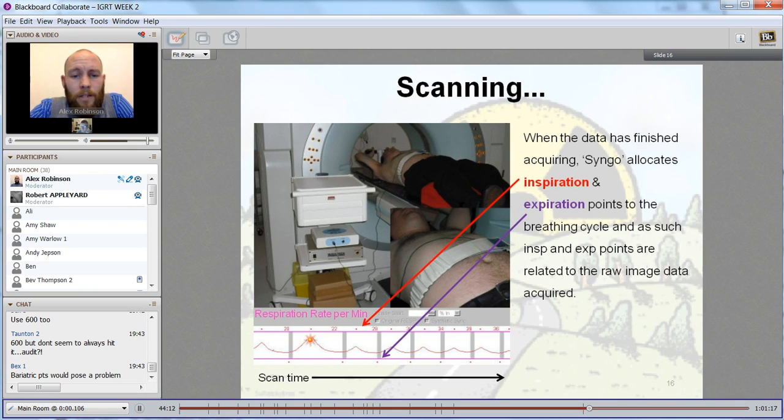Now on the system, it'd be lovely if this is how it turns up. However, it never does. You have to change your settings, and you've got amplitude, and my mind's left me what the other thing's called. But either way, we can change this to try and increase the peaks, but sometimes you just cannot get it.